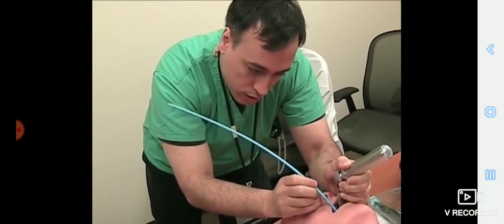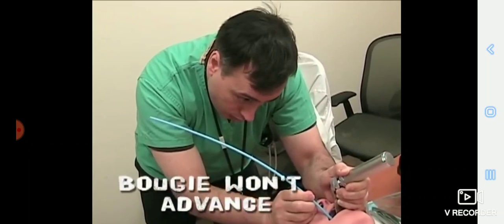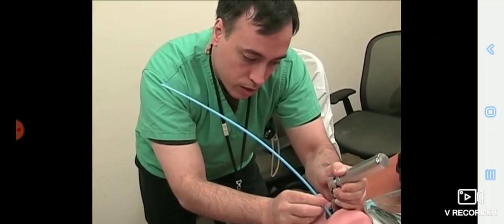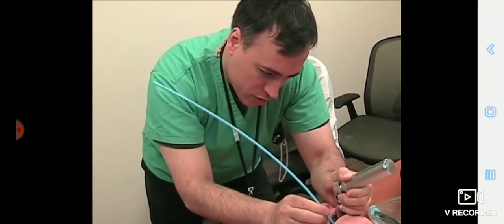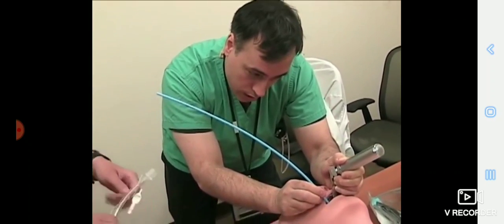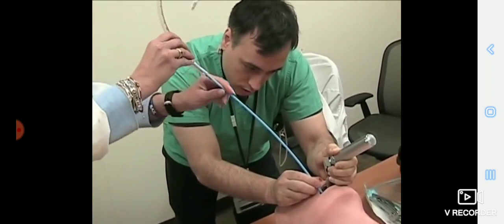If you're in the esophagus, on the other hand, it'll keep going. You could place that thing all the way to its hilt. So that's how you know. Once you've confirmed by holdup, that point of the bougie stopping, you just withdraw until you're at about 25, and then you'll put the tube onto the bougie. Now for this, you really want a partner. It's really tough to do yourself because one of the key mistakes that's made is taking the laryngoscope out of the mouth.